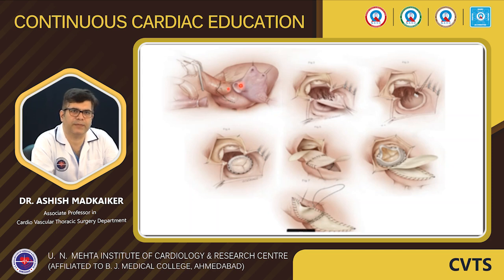And to improve the exposure, we can even divide the SVC so that we can now see aortic valve as well as mitral valve. Aortic valve has been excised, mitral valve anterior leaflet also has been excised. So this leaves behind this defect. As we see, the PML is intact, so we can take stitches all along the PML and anchor the mitral valve over those stitches.